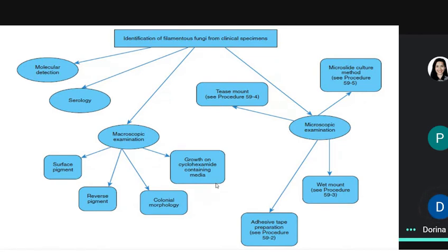And it is not yet entertained, it is still being developed. I went through some journals on molecular diagnostics of fungi. It's a pity our CPH session earlier was missed, there were so many researchable topics there. We can also do serology, that's why for filamentous fungi you have exo-antigen, I should have said. Then you do your macroscopic.